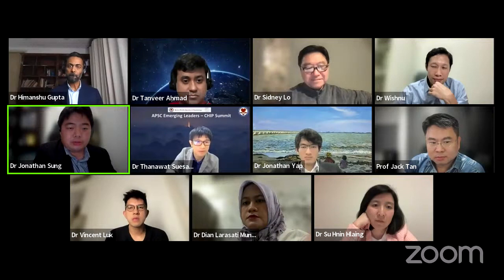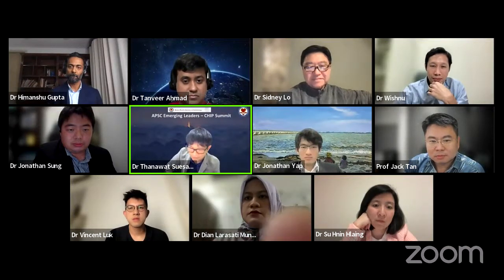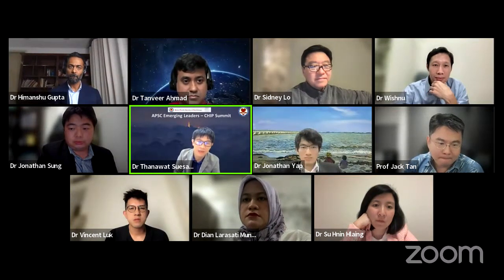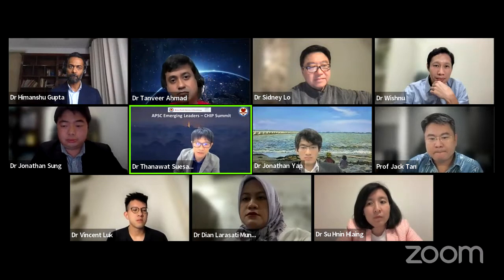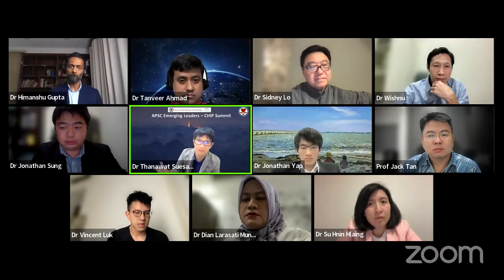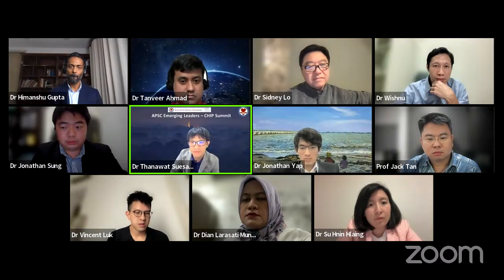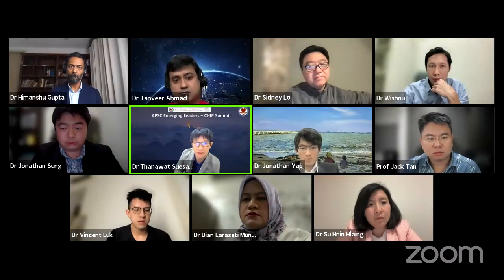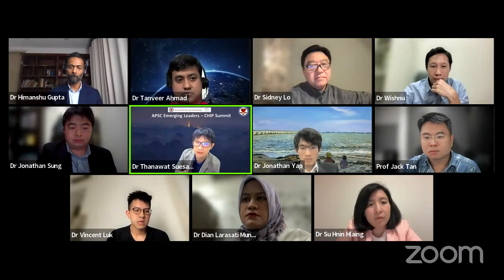Panel, you have a comment here? Yes. I have a question about the nodular calcium. It's very difficult dealing with nodular calcium. In my experience, I just used Rotablator in combination with the cutting balloon or high pressure balloon. But the initial result is okay, but with follow-up, it is not good. It has a high rate of in-stent stenosis after nodular calcium management. So I want to ask Dr. Gupta and all panelists, what is the best device, or has anyone had experience with orbital atherectomy to manage nodular calcium?